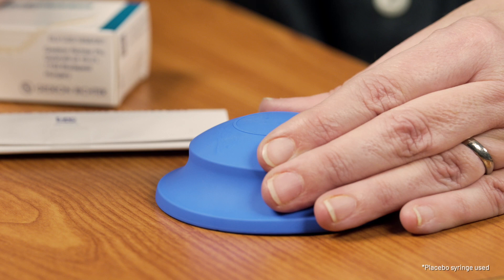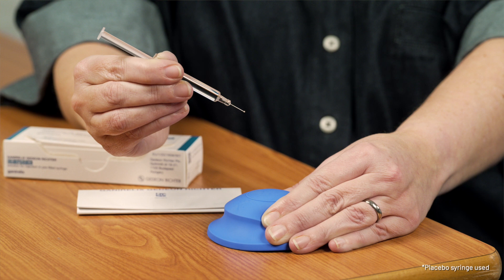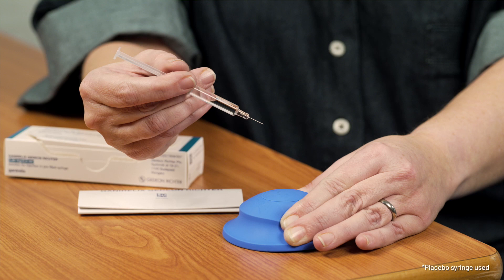At the chosen injection site, pinch up a fold of skin between your index finger and thumb and hold the syringe with your other hand so that you can place your thumb onto the plunger when needed. Ganarelix Gideon Richter should be injected into the fatty layer just under the skin. Insert the needle completely with a quick firm action into the middle of the pinched-up skin at an angle of 45 degrees to the skin surface.